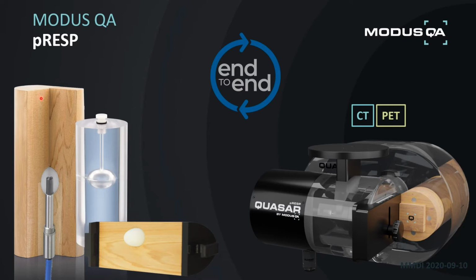And just on the left side of the screen here, there are some targets or inserts that are zoomed in a bit. The first one shows you a cutaway of what you can do with this device. You can have a tumor model that is used for planning purposes, and you can have it pre-drilled for any custom ion chamber holder that you have, and then you plan your treatment to this volume, and you can verify the accuracy of your gating process or even static processes if you choose.